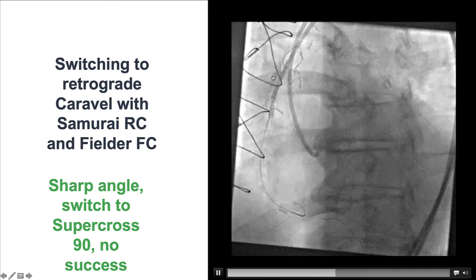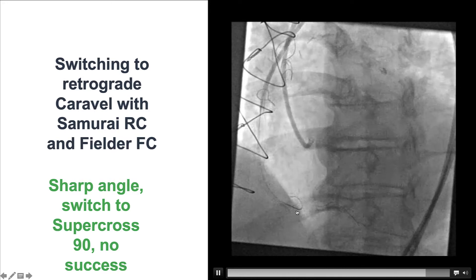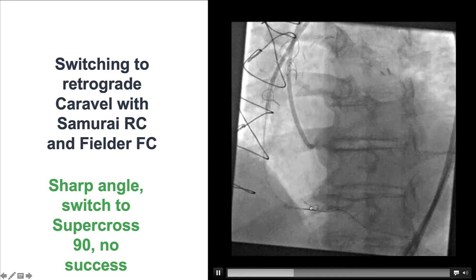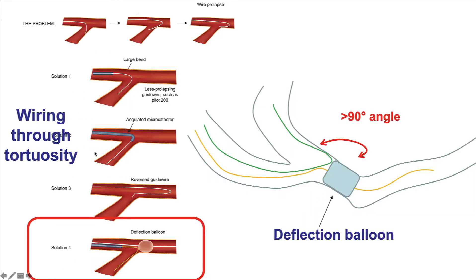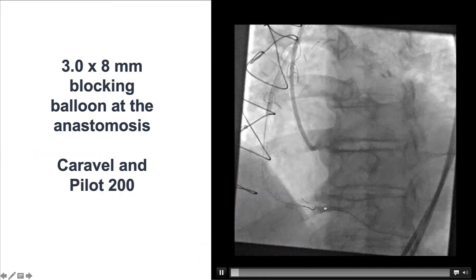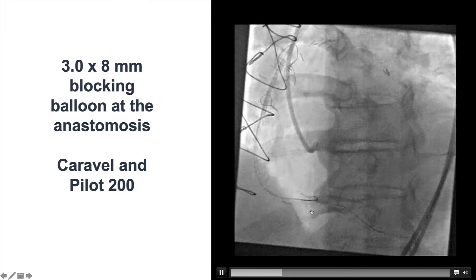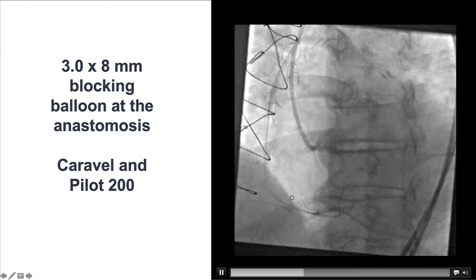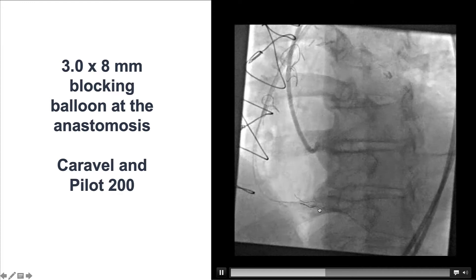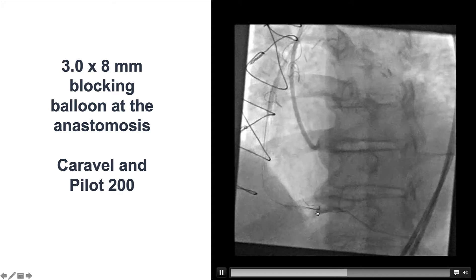We engaged the vein graft to the right coronary with a multi-purpose guide catheter. We had difficulty advancing equipment retrograde in the distal RCA due to a very acute angle. One way to deal with this tortuosity is the balloon deflection technique, in which a balloon is inflated just at the bifurcation, blocking advancement of the wire into the distal vessel and providing support for the guide wire and microcatheter through the area of tortuosity. A small deflection balloon was inflated into the right coronary artery distal to the touchdown, allowing us to advance a Pilot 200 and a Caraval retrograde into the distal RCA. The deflection balloon technique is extremely useful for highly angulated distal SVG touchdown anastomoses.